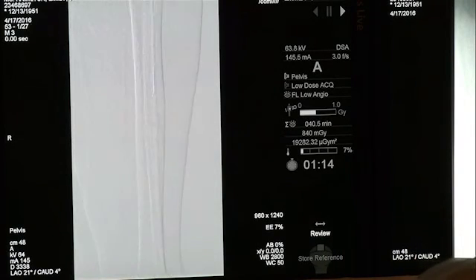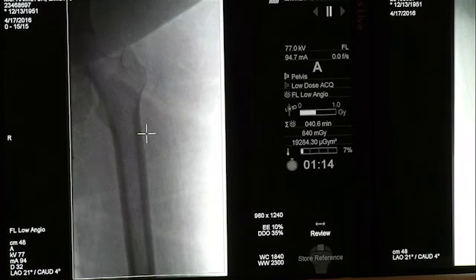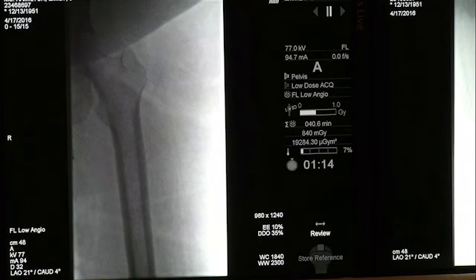I'm going to give some nitro, but while they're getting the nitro, let me show you the proximal SFA so we can see what you guys think. Sure. And then we can go off air. We can finish the rest of it off air here with a couple DCBs. So we give some nitro. Let me show you a couple pictures of the proximal SFA.